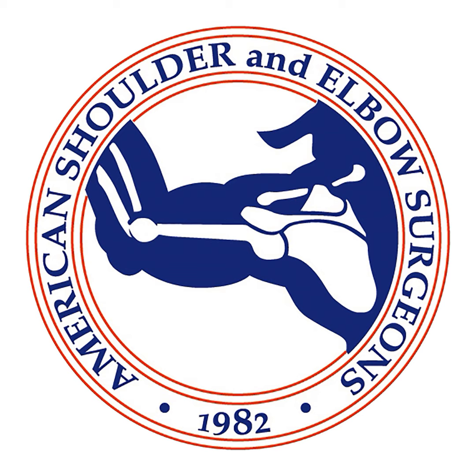You want to put the implant in stable, so you don't want it to be too loose, so you put it in tight. And if you do enough stem implants in a press fit fashion, at least once in a while, you're going to crack a humerus. So one of the disadvantages of a stem is the risk of an intraoperative humeral fracture.